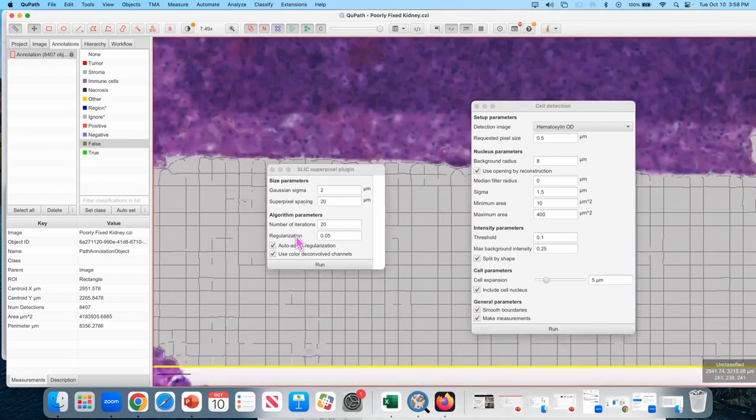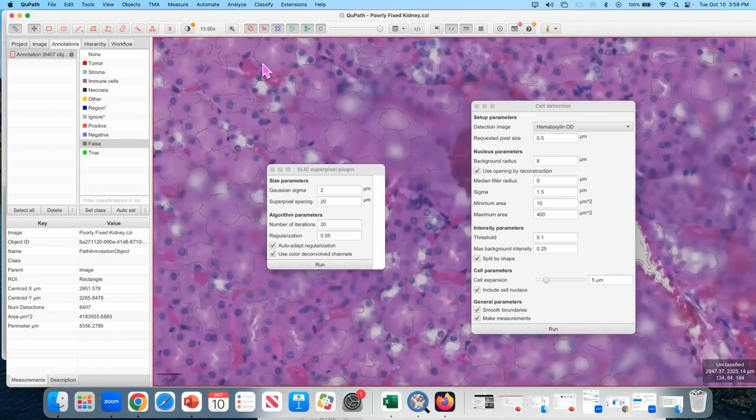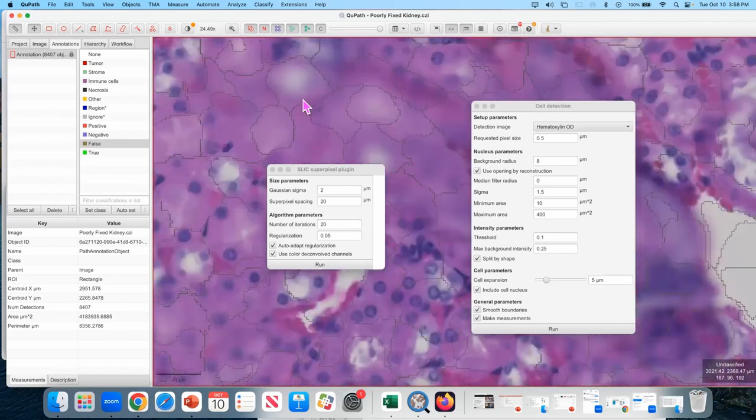And auto adapt, what it does is, where there's contrast to be had, it uses a lot of weird shapes, and where there's just nothing, it just leaves things square. What I really like about this is it gets boundaries at a pretty high resolution, but then allows you to step back and do the classification at low resolution.